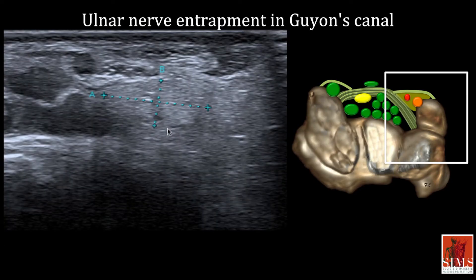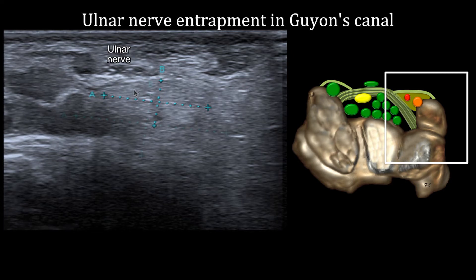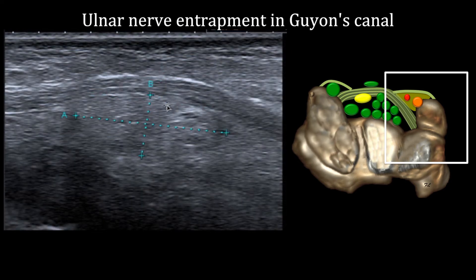Ulnar nerve entrapment in Guyon's canal should make us look for a tumour or mass. On this axial view we see a poorly defined hyperechoic structure in contact with the ulnar nerve vessels. On the sagittal view you can clearly see this oblong hyperechoic structure which lifts the ulnar nerve and corresponds to a compressive lipoma.